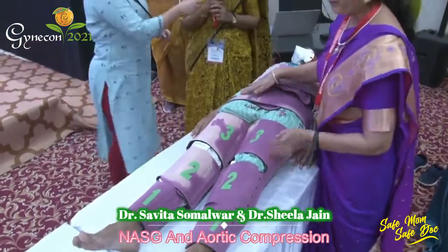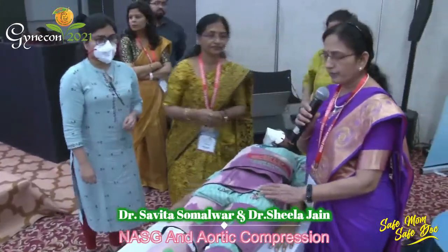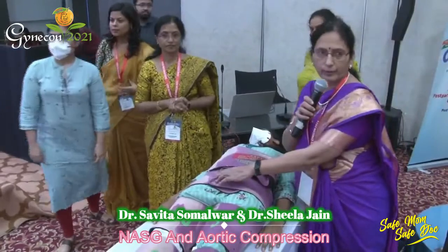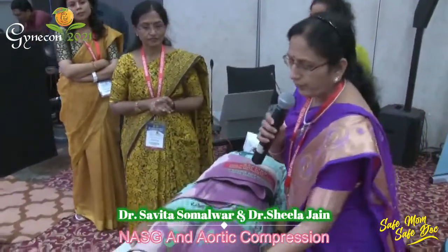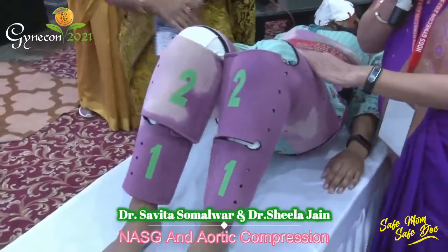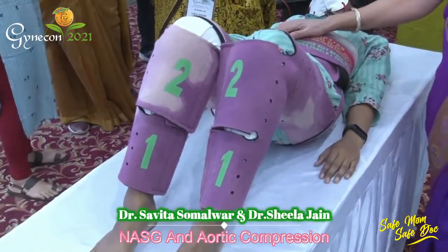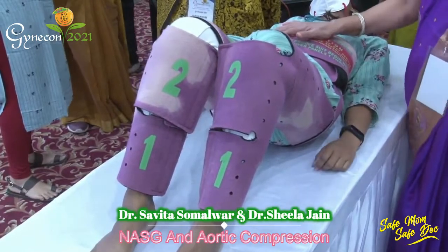You can shift the patient to the OT with the NASG garment in place, and remove only the abdominal segment when you want to do a laparotomy. You can flex the knees because they are open, allowing exploration in situ. You can also give uterine massage because the abdominal segment is stretchable, so there is no need to remove it.